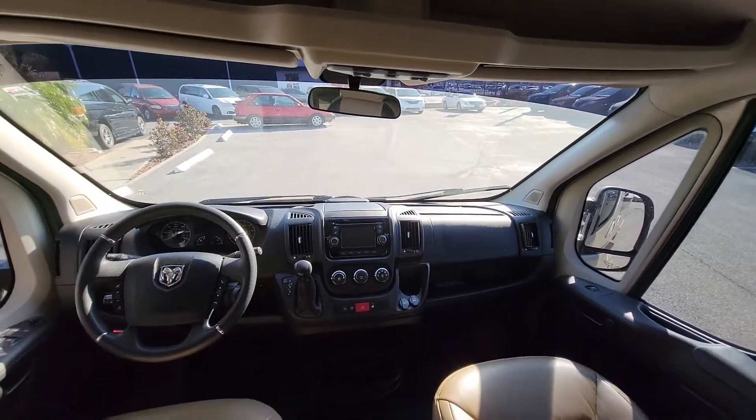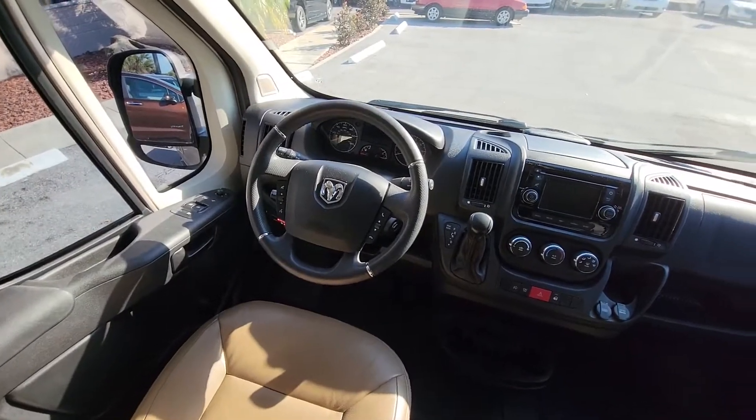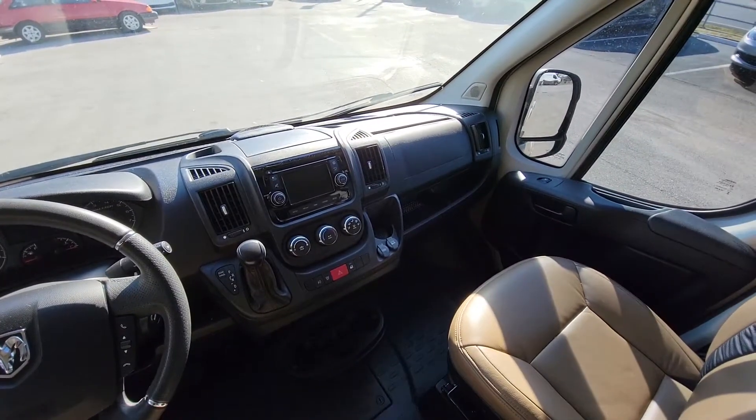The driver's area of the ProMaster is very spacious and nicely designed. Anyone would be comfortable behind the wheel of this awesome full-size wheelchair van.